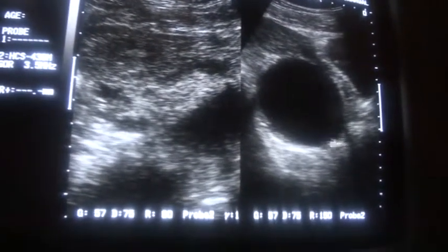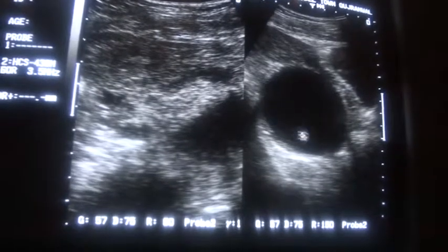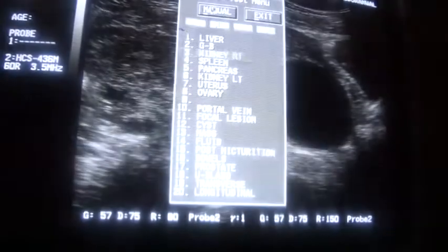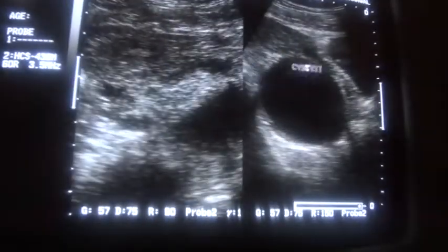I have a cyst. I see no cysts. This is a cyst.